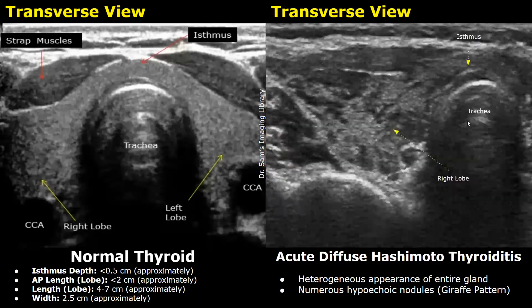This image is focused on the right lobe of the thyroid. Numerous hypoechoic nodules are present and the thyroid lobe has a heterogeneous appearance. This type of appearance, along with the abnormal lab tests shown earlier, indicates Hashimoto thyroiditis.